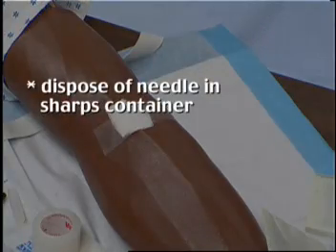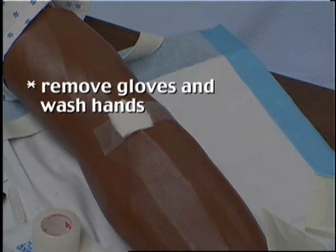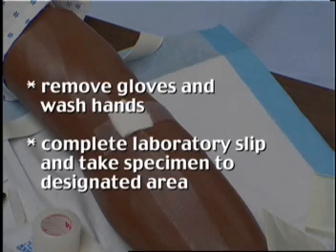Dispose of needle in sharps container. If tube contains an additive, gently invert to mix. Remove gloves and wash hands. Complete laboratory slip and take specimen to designated area.